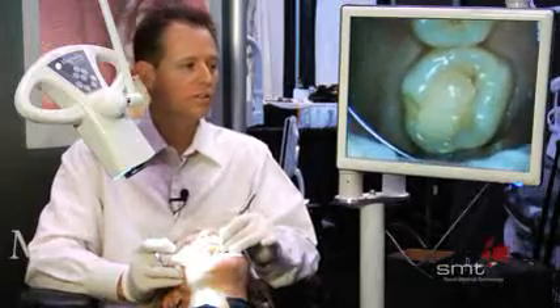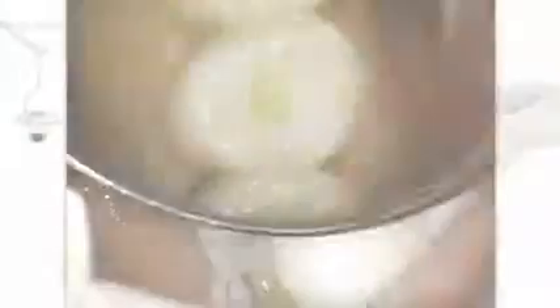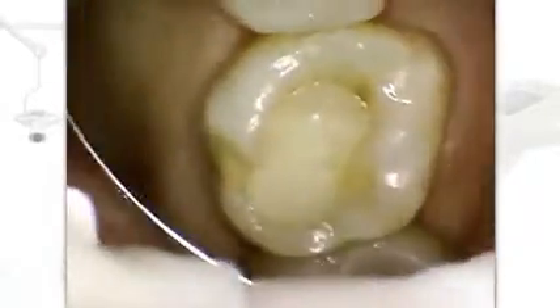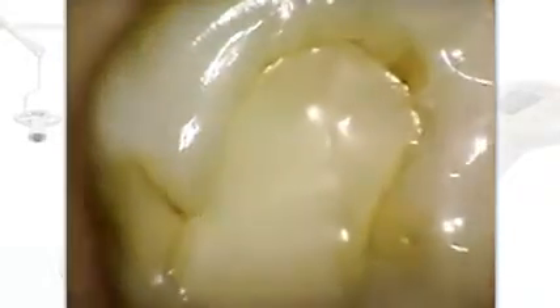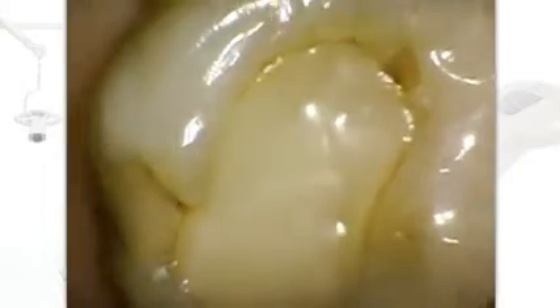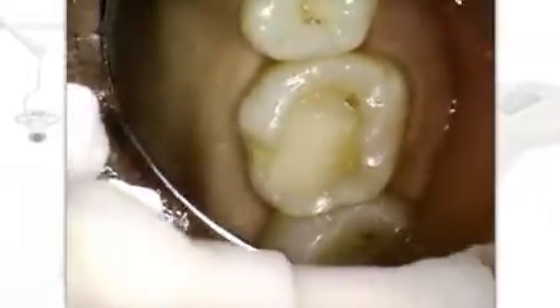Now I'm going to show you how the Dentaloscope 2D looks when we're working on an actual patient. You can see how much more alive the teeth are. You're able to see old fillings, zoom in and zoom out. You see so much detail that you normally wouldn't be able to see, and we can do the entire quadrant real easily.